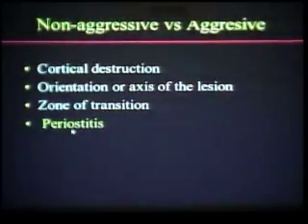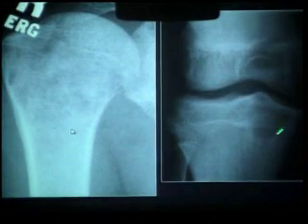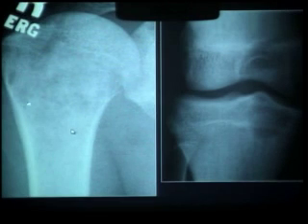Very good. Doctor, yes. What were the diagnoses on those two cases? This was a chondroblastoma, epiphyseal chondroblastoma, and this one I don't know. Could it be a myeloma? This one? No, the first one. This one could be, but in an epiphysis, I can be... It looks like it, yes. But this could also be infection, could be lymphoma. Usually myeloma is more lytic, more well-defined, but could be.